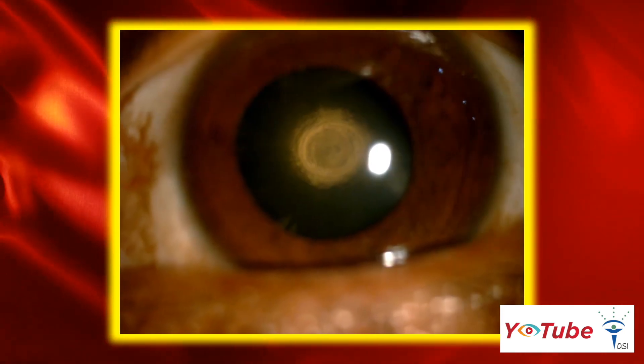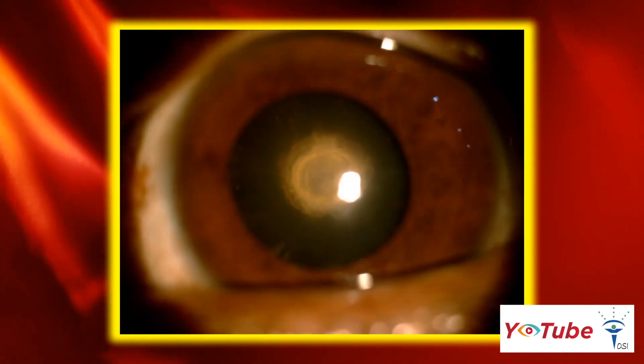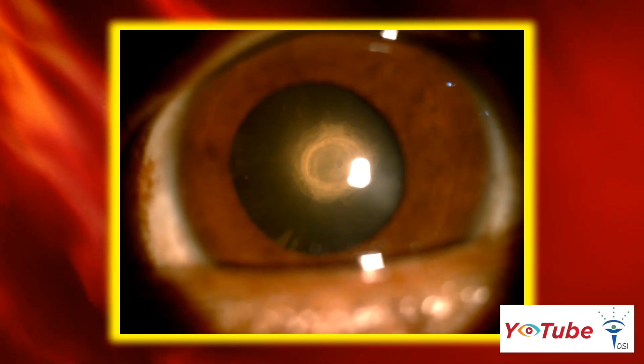Identification of the posterior polar cataract on dilated slit lamp examination is the first step in successfully managing this type of cataract. The cataract has a characteristic bullseye or onion peel appearance in the central part of the posterior capsule.